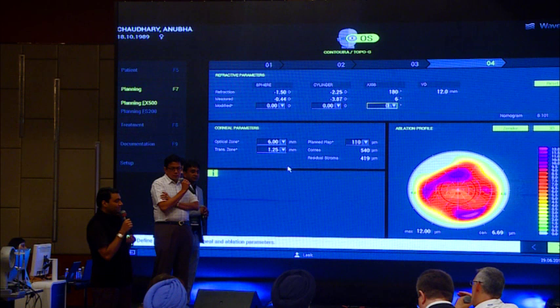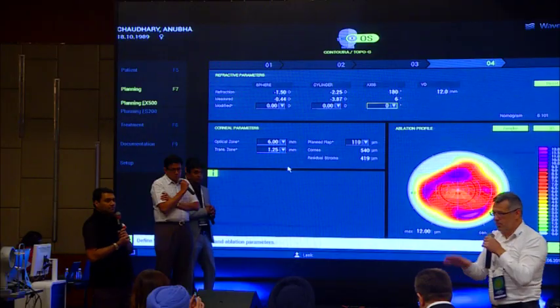They should have, even if you would have treated with CONTOURA, they should have come out equally well, but they did come out better. This shows also that there's something more to topography guided, and this is something that I would like you to pay attention to. Topography guided is not wavefront optimized, period. Topography guided, even with the same power, with the same astigmatism, and with low order aberration, does a better job than any wavefront optimized or custom Q treatment.